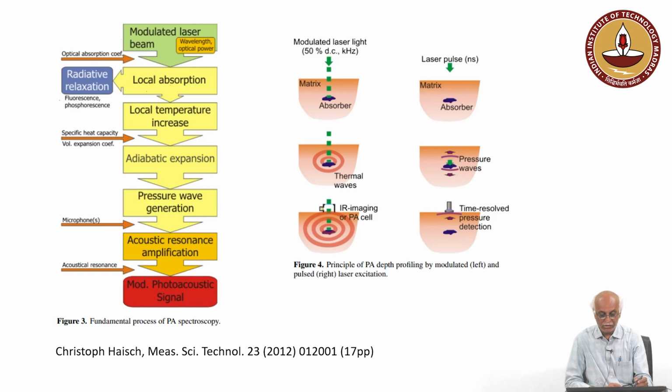So, these sensors will pick up acoustic waves with a frequency of the order of sub megahertz, or megahertz, and this modulated photoacoustic signal is used for imaging purposes.